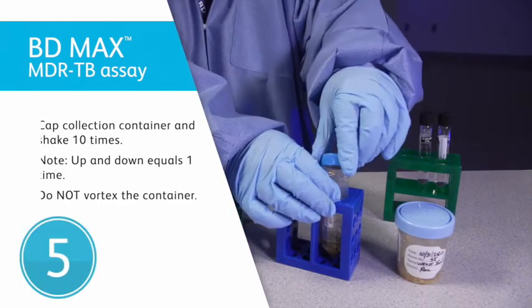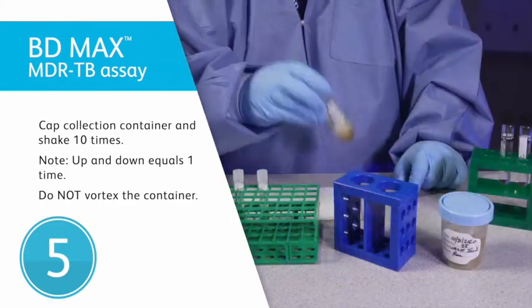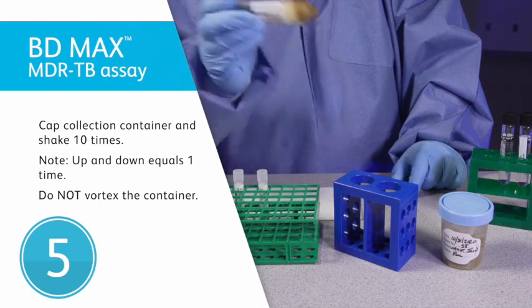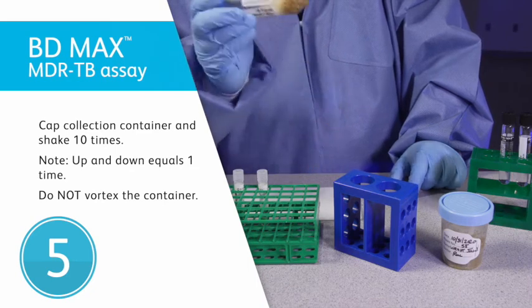Cap the sputum container and shake the solution vigorously 10 times. Up and down equals 1 time. Do not vortex the container.